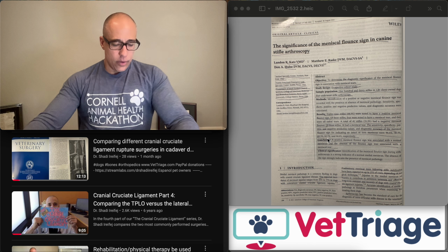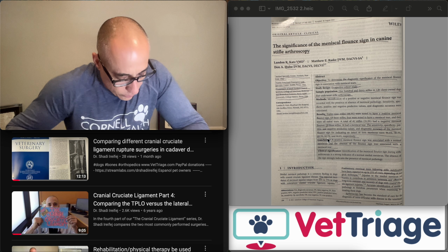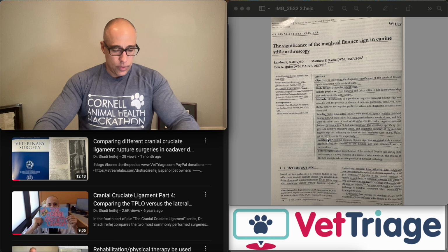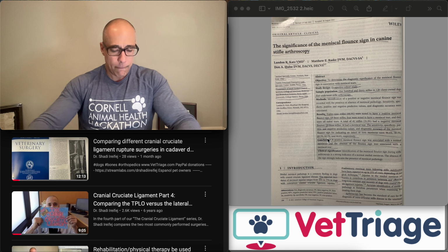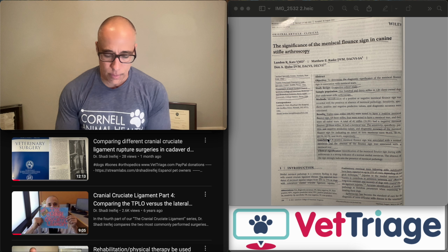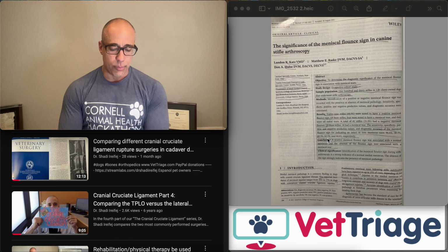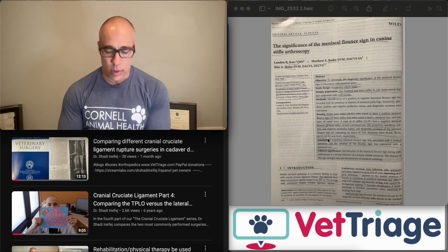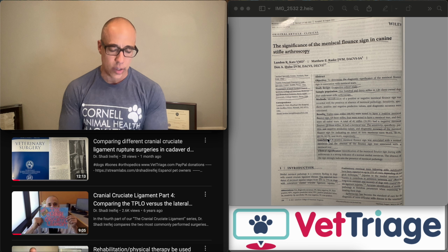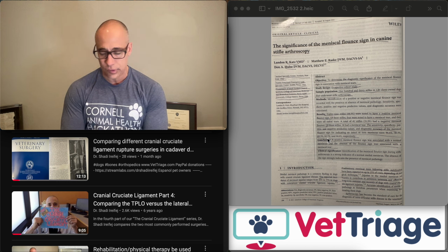This study comes out of a specialty center in Yonkers, actually, where I was born, another specialty center in Austin, Texas, and the vet school at Texas A&M. The objective is to determine the diagnostic significance of the meniscal flounce sign in association with meniscal tears. It's a prospective cohort study, 130 stifles in 120 client-owned dogs that underwent stifle arthroscopy. Results found that 68.5% had a positive meniscal flounce sign.